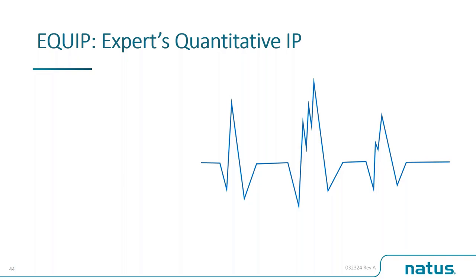As I indicated, we typically look at how full the pattern is. So we have a parameter called activity, and it measures the time when we get sharp motor unit potentials. This is where we have sharp signals, and this is where we have baseline, so we don't measure this time. We add all of this time, and that is called activity. It can be expressed as a percentage of the recording epoch or as an absolute value. But typically, when the activity is more than 50%, the EMG interference pattern appears full to all electromyographers.